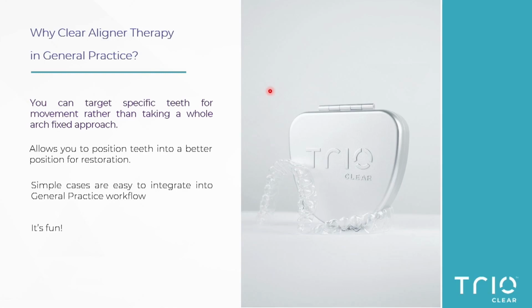Why clear aligner therapy in general practice? The big advantage in general practice is that we are able to target specific teeth for movement rather than taking a whole arch fixed approach, which is what you would traditionally take with fixed appliance therapy. In other words, every tooth that you put a bracket on and a wire on in fixed appliance therapy will move. Whereas in clear aligner therapy, that's not necessarily always true.